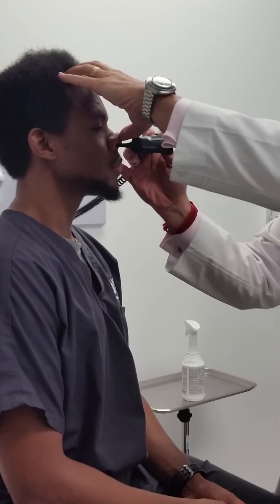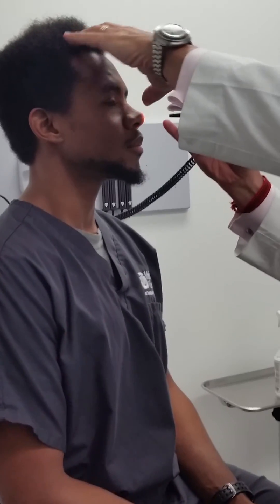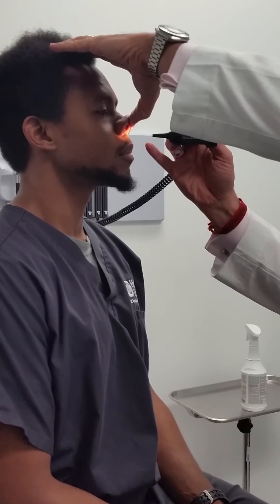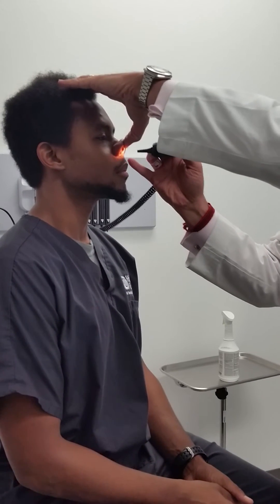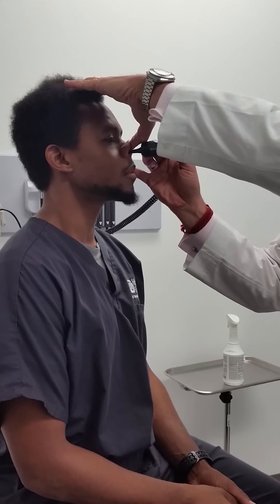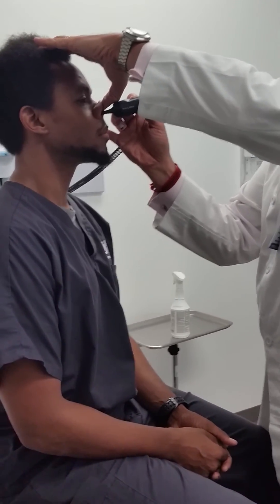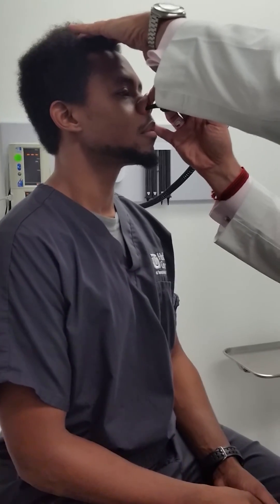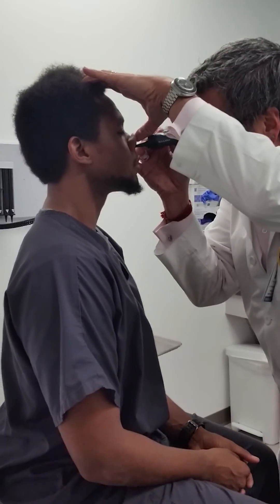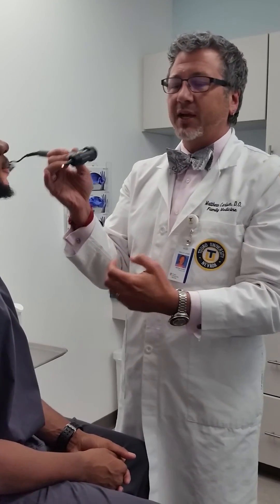I'm going to look at the nasal structures with a little bit of light, making sure superficially I have symmetrical structures — no swelling, no deviated nasal septum. With the piggy nose I can look for superficial obstructions. The speculum is then placed inside the nares and I push upward on the nasal speculum against my thumb, not pressing against the patient's nose itself. I tell them to take a breath and hold it. I can then observe the inferior turbinate and the middle turbinate, then repeat this on the opposite side to investigate both nares.